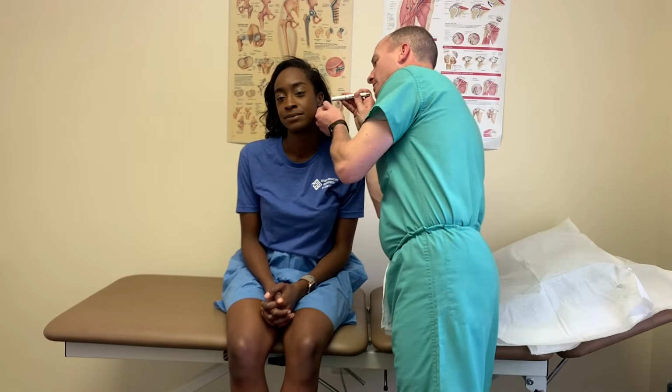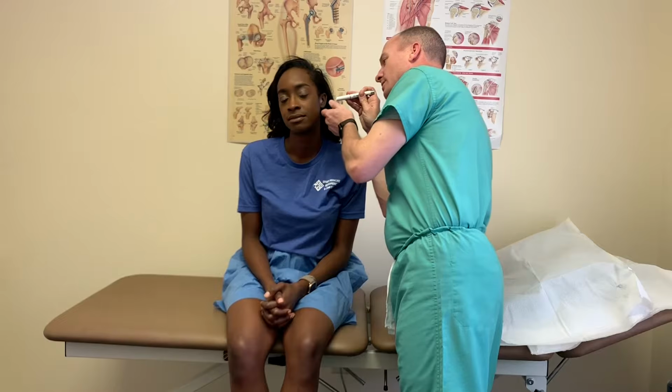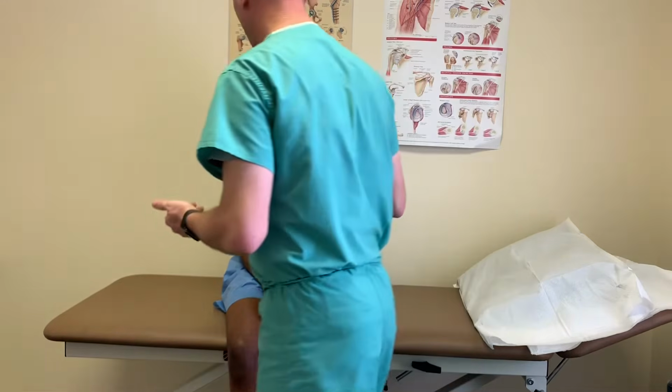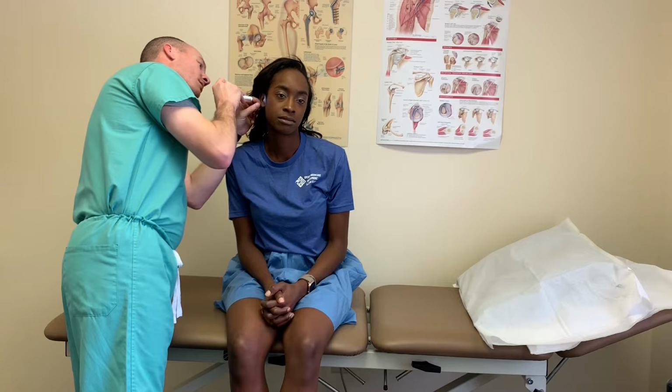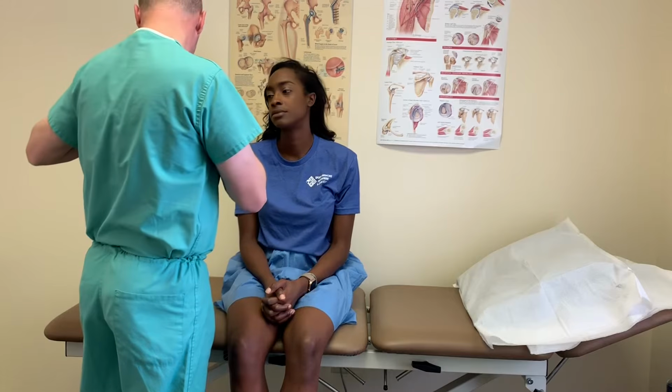I would insert it here into the ear, and I would be visualizing these structures of the tympanic membrane, looking for its normal color, which would be pearly gray, looking for a couple of landmarks, such as the pars flaccida and the handle of the malleus. And I would be looking for any evidence of perforation, which I hopefully would see none.